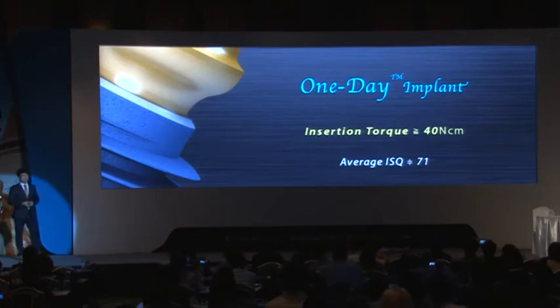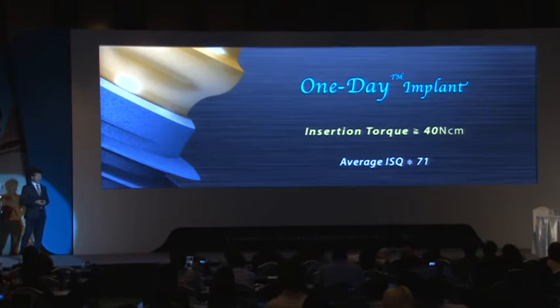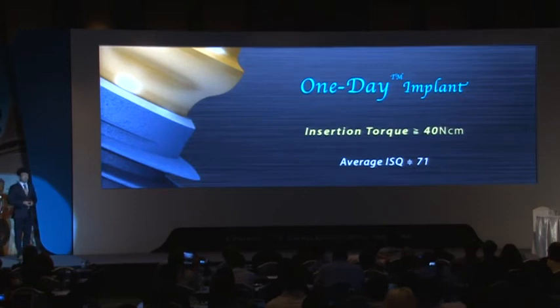But when it comes to immediate loading, I think high insertion torque is more essential. And I performed immediate loading of Anyridge with these values, and I got a good result.